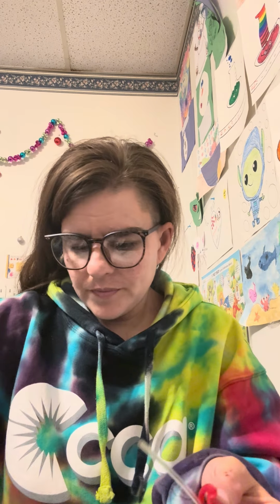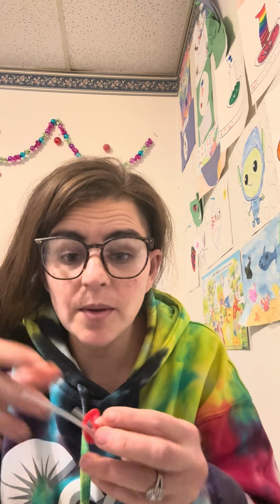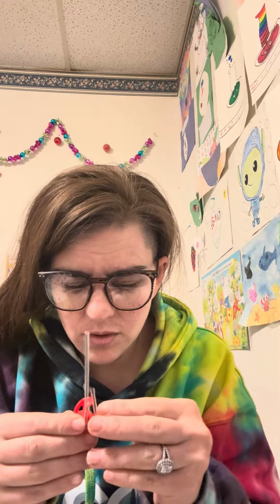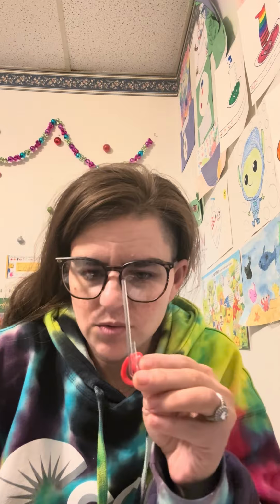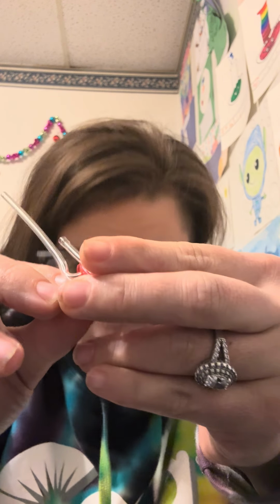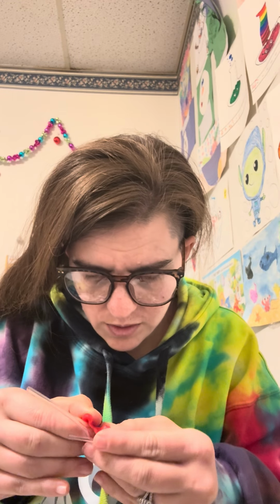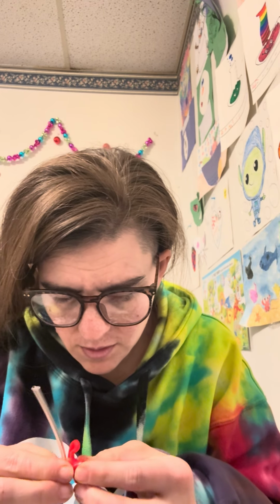So what you want to do is cut it. You can use your other tubing to measure it. I always measure it with my other tubing, but don't do it exact. I do it longer because it does shrink up. So you do it longer than your actual tubing, because this will shrink up, especially if it is really hard. So I line it up like this to where it would be in the ear, and then I cut it a lot longer than it needs to be, or a little, depending on how experienced you are with doing this process. So let me show you.